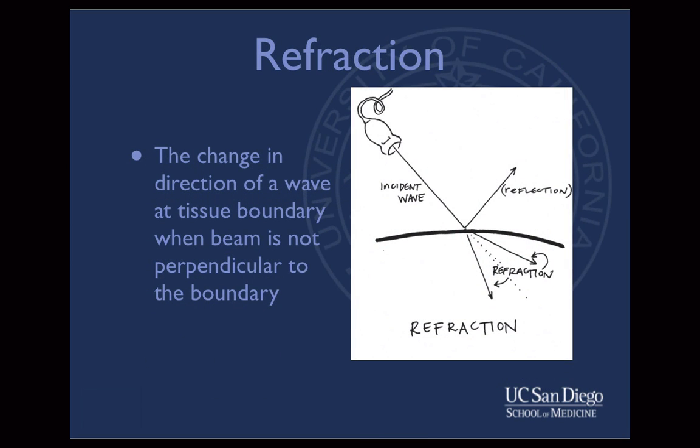Refraction refers to the change in direction of a wave at a tissue boundary when the beam is not perpendicular to the boundary. Based on the velocity of sound between two mediums, the refracted wave may move towards the center or away from the originating beam.